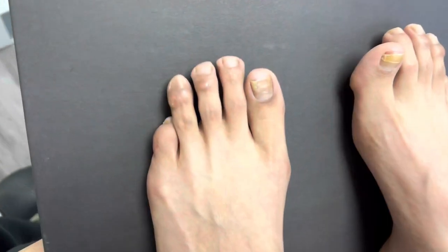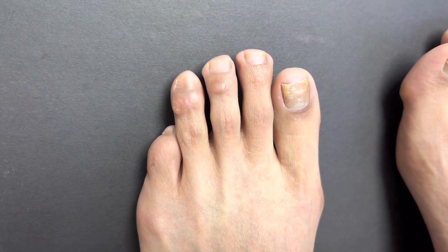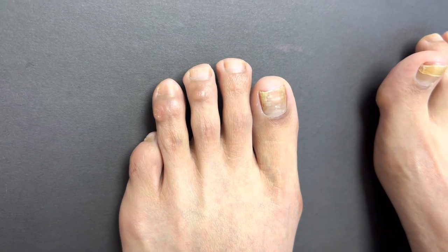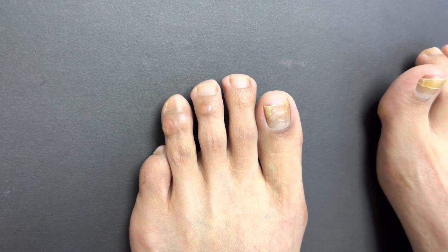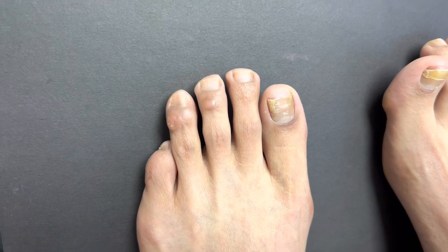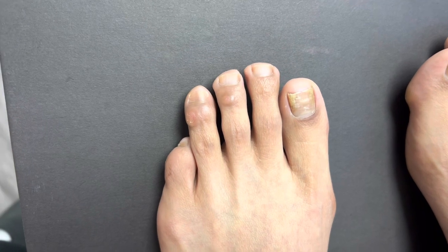We're going to shorten the second, third, and fourth toes to reestablish the parabola. This is a minimally invasive approach — a plantar keyhole incision approach, and also incisions in between the toes. We hide all the incisions underneath the toe and in between the toes.